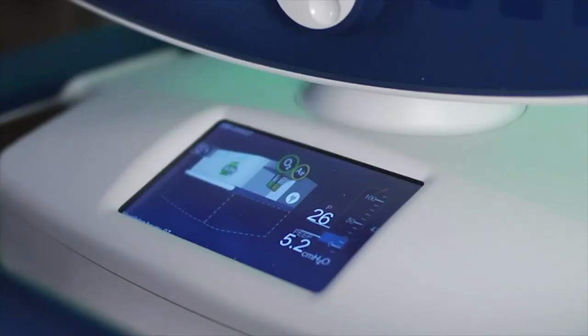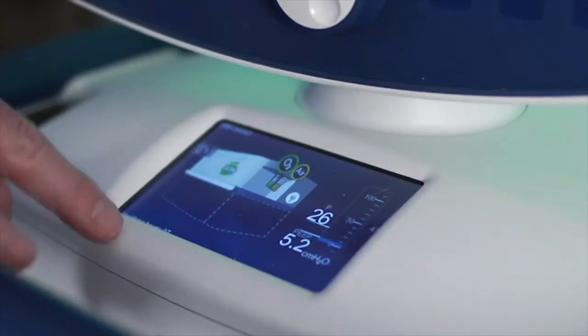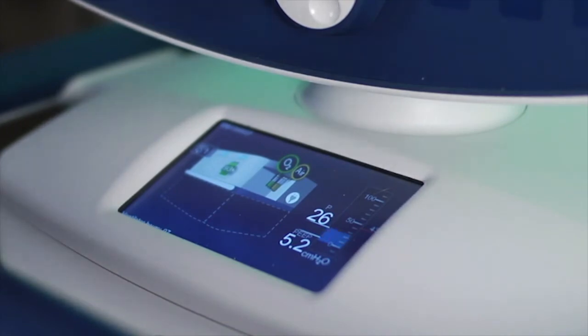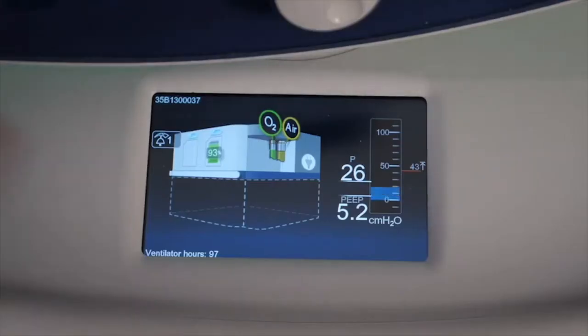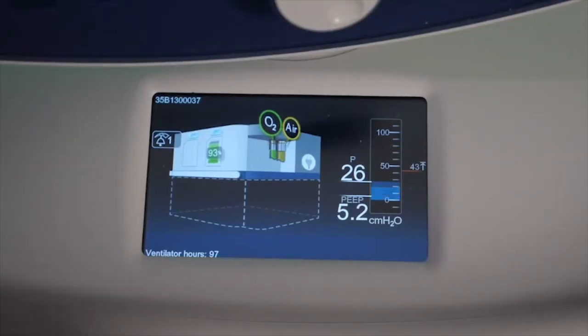There is one more thing I want to show you on the status display, but I have to turn the unit off and back on to show that, so I'll return back in a second.